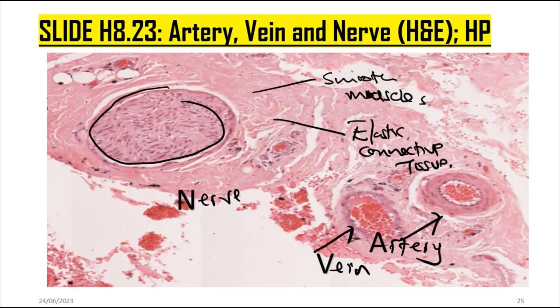Another identifying structure is this. Have you seen inside of the vein, there is red substance inside there? This red substance is simply red blood cells. Even in the arteries, there is blood here. So these are red blood cells that are present inside of these blood vessels. Okay.